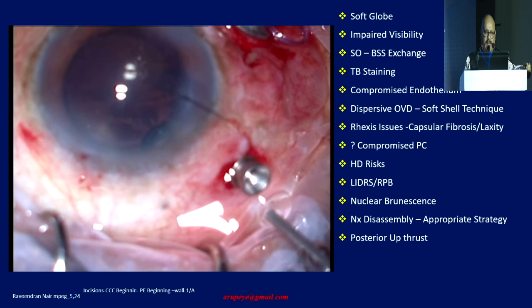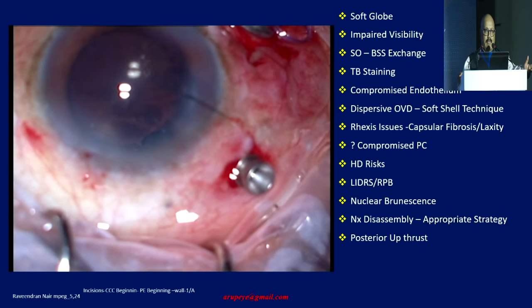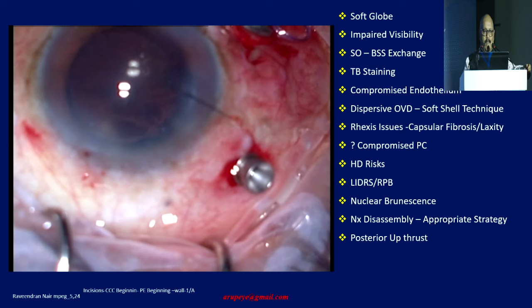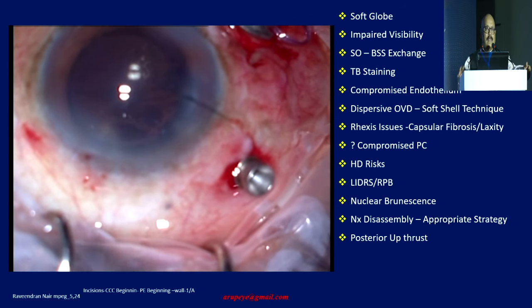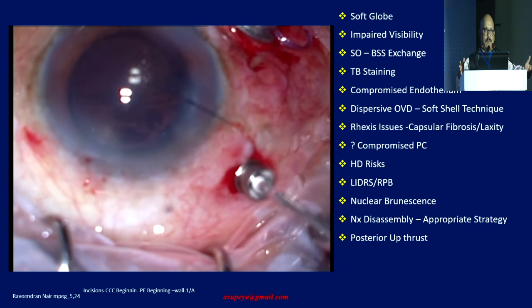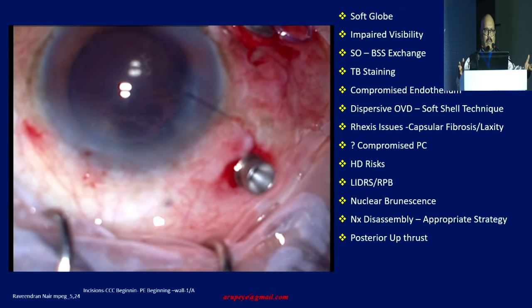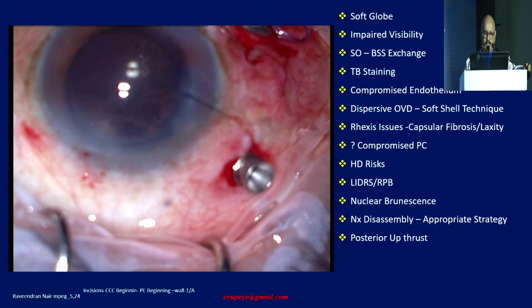So here Dr. Meena goes in and, after evaluating the posterior segment, she decided that yes, the removal of silicone oil was indicated and silicone oil was removed from the posterior segment. So we didn't have to really alter the intraocular lens power in this particular case. In certain situations where the silicone oil is planned to be left in situ for a long period of time, let's say a young patient or a moribund patient who won't live long, we would like to give them a good vision, so we adjust the intraocular lens power.